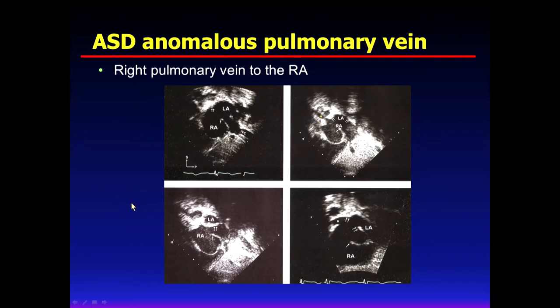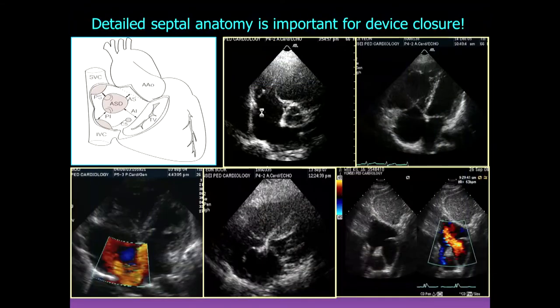It's combined very often. Especially here, you can look at the pulmonary vein. The right side pulmonary vein drains into the right side atrium. Here, the right side atrium together. So three of them drain into LA, but one drains into RA. In this case, we need to look at whether the saturation is okay, or if we let it go, or what to do, we need to decide.